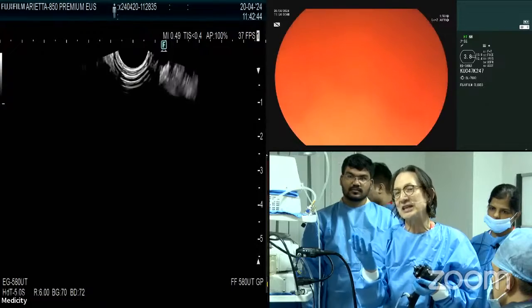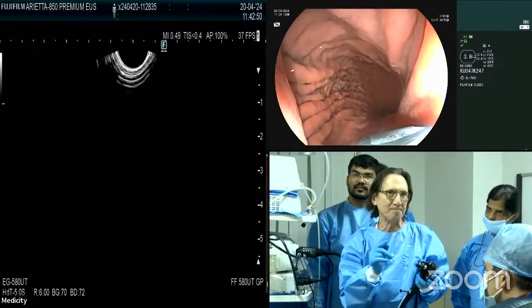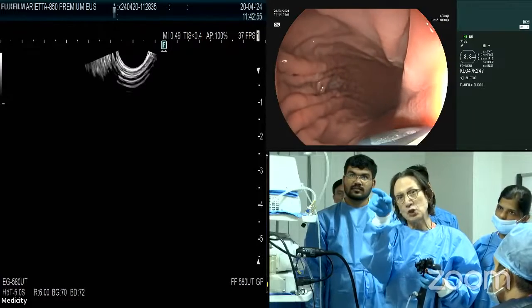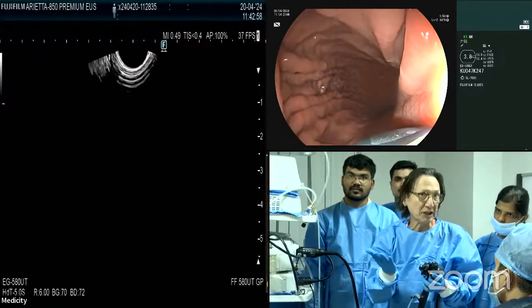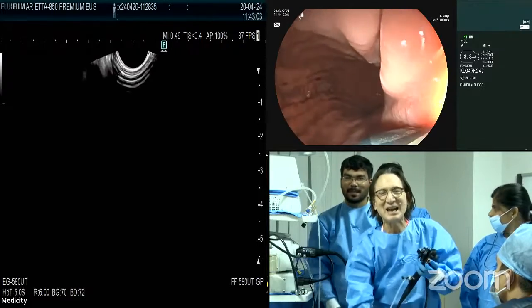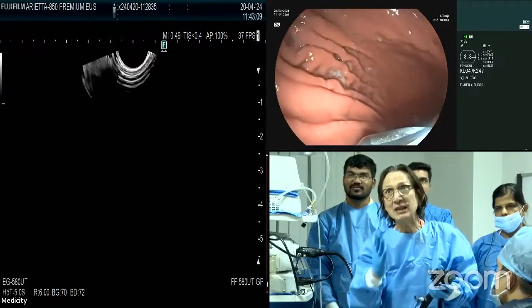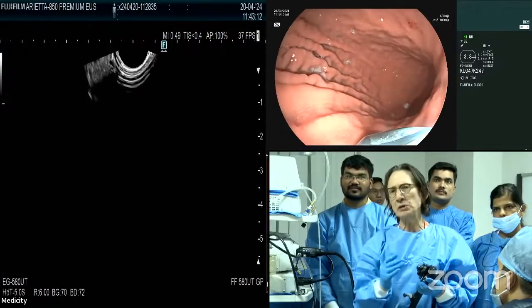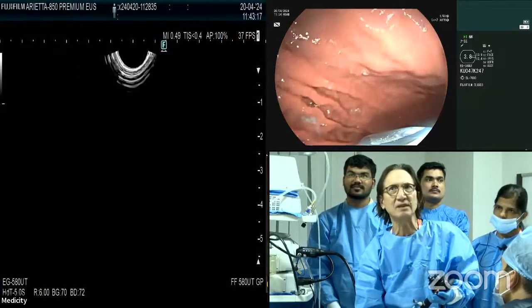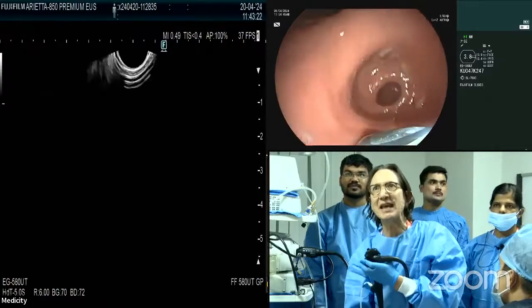Now we carefully advance across the GE junction. With the Fuji scope you'll notice you actually see the tip of the transducer ahead of you, which you don't with the Olympus — I was a little puzzled by that at first, but that's just the tip of the transducer. A beautiful view of the stomach, and if you only looked at this endoscopically you'd say there are no gastric varices — maybe a little portal hypertensive gastropathy, but otherwise it looks fine.